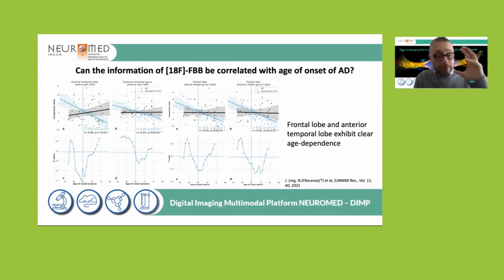Such specific quantitative information from the PET image can then be used to develop a clinical digital imaging biomarker.